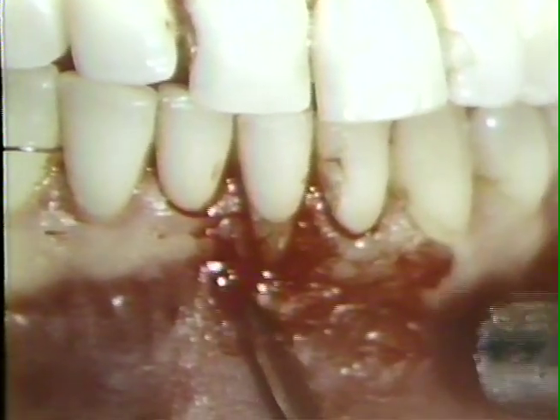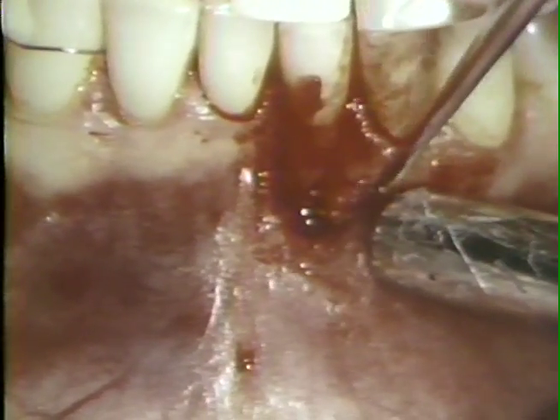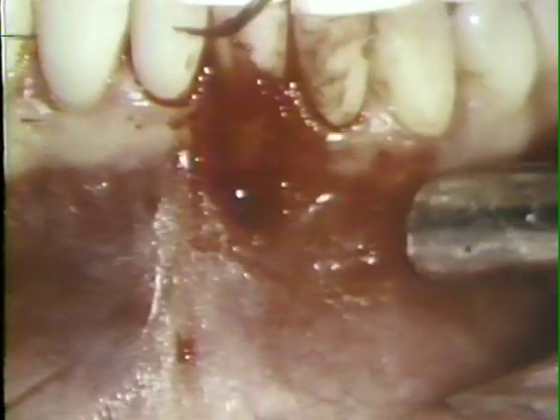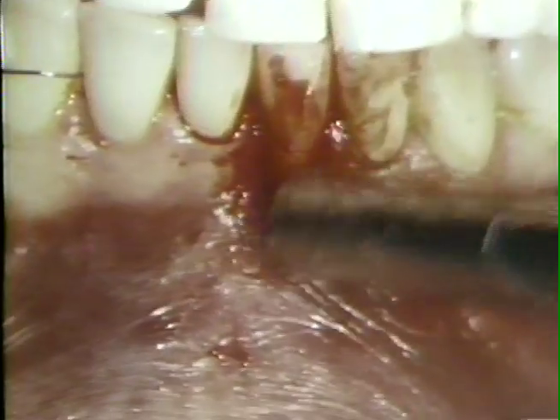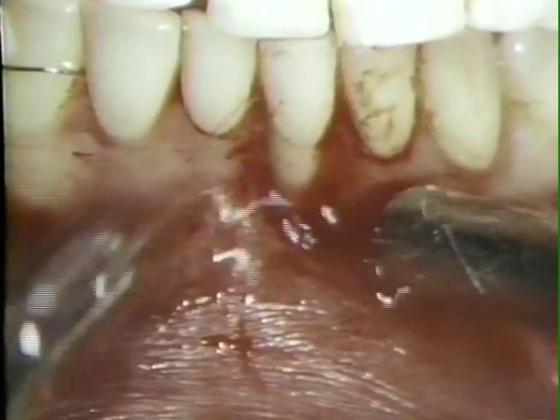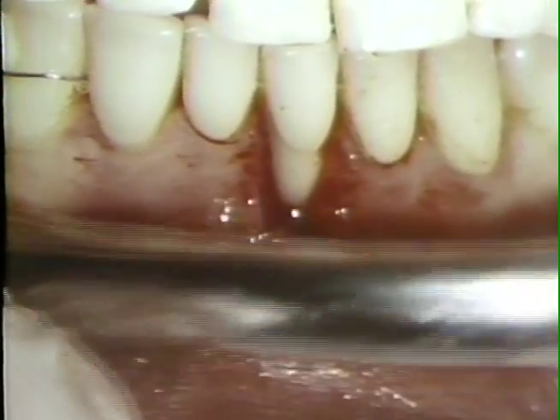A horizontal incision is created at the base of the cleft. With the Goldman Fox number 12 curette, all the loosened tissue adjacent to the cleft is removed. The area is irrigated and carefully inspected for residual soft tissue tags, calculus, or debris.